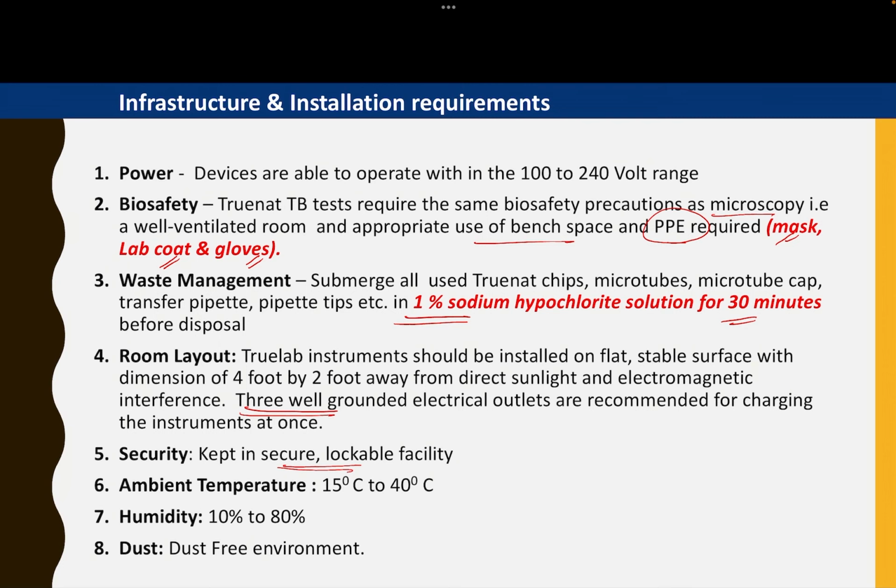Ambient temperature for our Indian condition is 15 to 40 degrees Celsius. It works under humidity of 10 to 80%. In Port Blair, the humidity is 80 or higher.